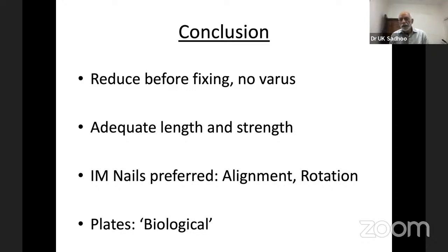Any distal screw, whether it is in the plate or in the nail, you have to have adequate external rotation to match the natural external rotation. Yes, there is no radiological landmark, and it will be very difficult to compare in lateral position, because the picture generally is not as clear. Yes, I think the thing to avoid is varus and internal rotation.